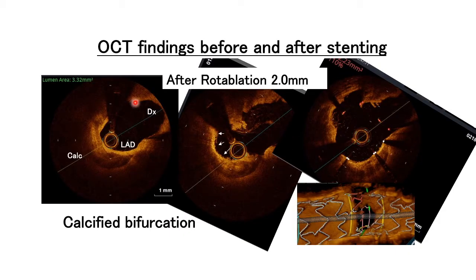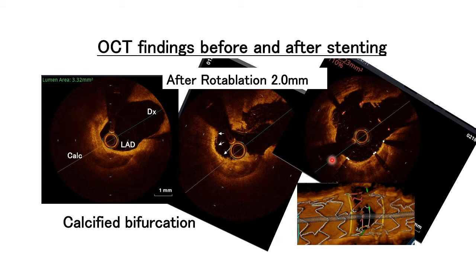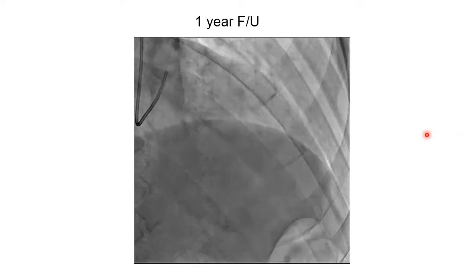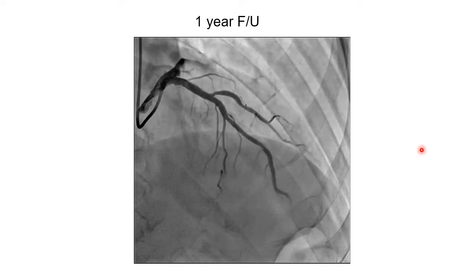OCT shows that the calcium was ablated by rotablation. After stenting, no carina shift happened and wide opening of the stent was achieved. One-year follow-up shows no restenosis.